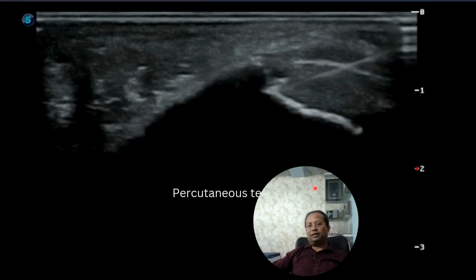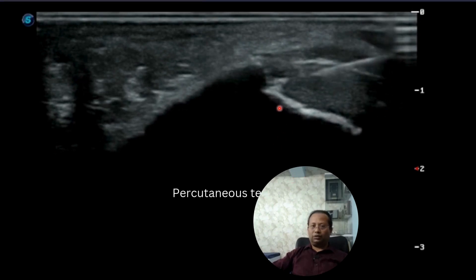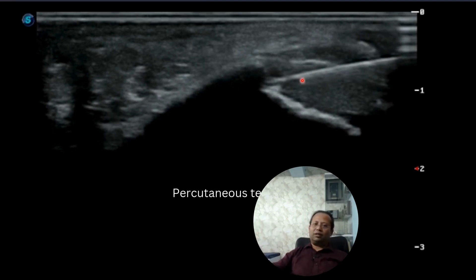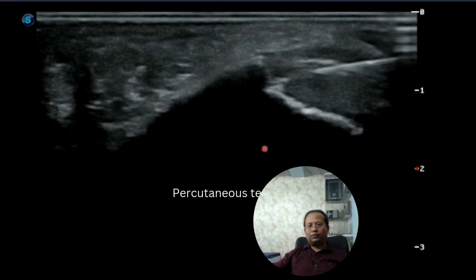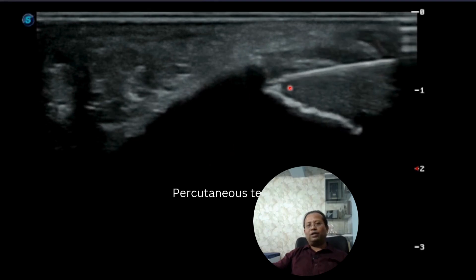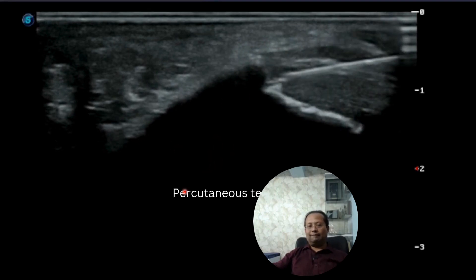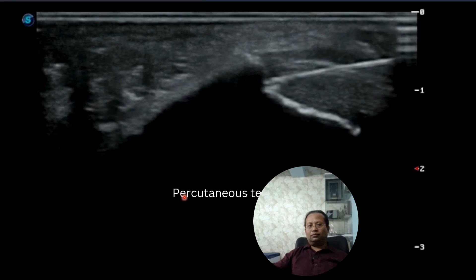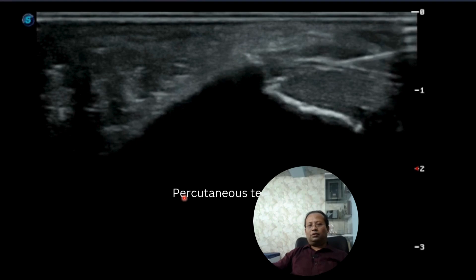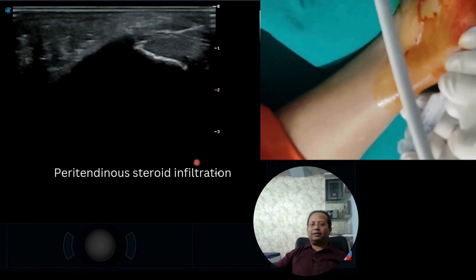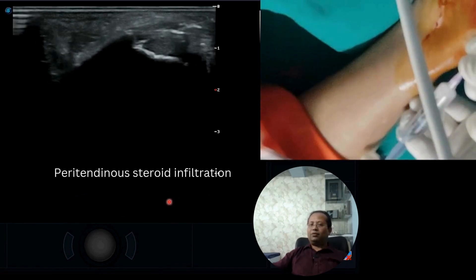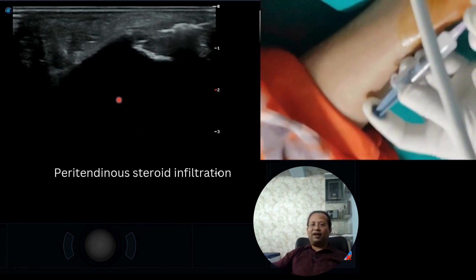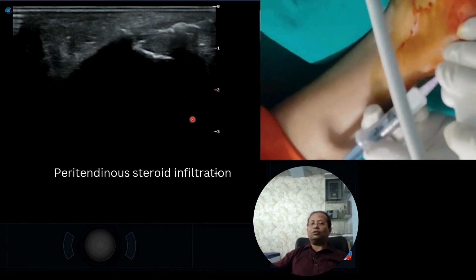What we are doing here is percutaneous needle tenotomy. In this treatment, we inject the tendon with a normal 23-gauge needle 15 to 20 times, which causes the percutaneous needle tenotomy. You can see how the needle tenotomy is being done at the hypoechoic area visible under ultrasound. One important point: steroid should not be injected inside the tendon fibers, as it can cause tendon rupture.